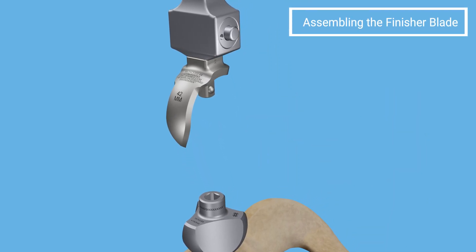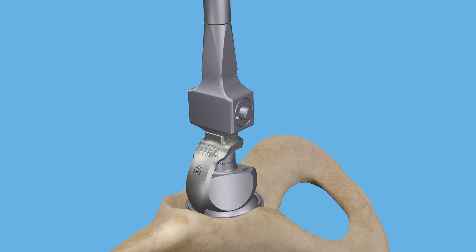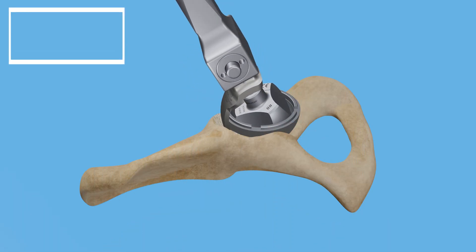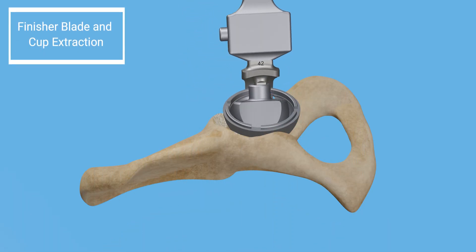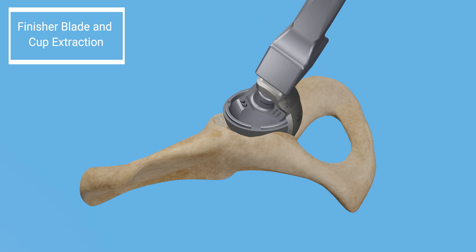To complete the cup removal, assemble the finisher blade with the centering device. Perform a second round of plunge cuts utilizing the finisher blade to complete cup extraction.